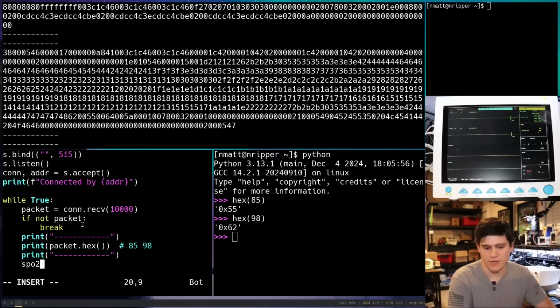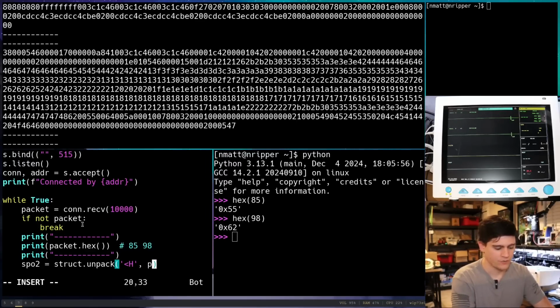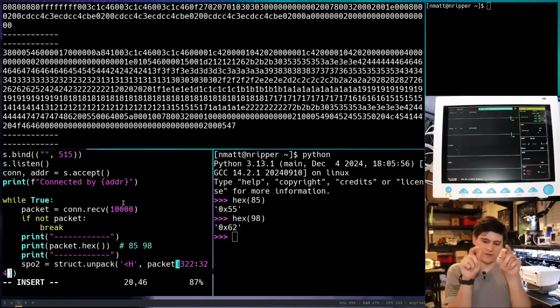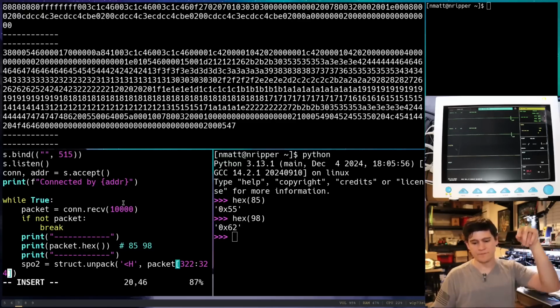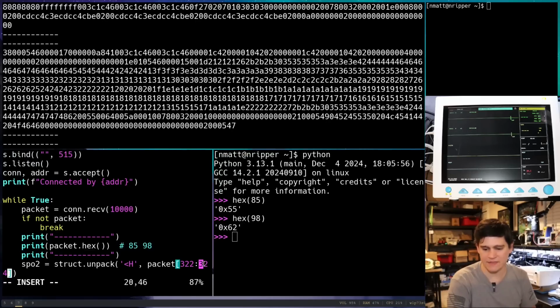Okay, so we're going to say pulse ox, which is called SPO2 here. We're going to set this equal to, and then we're going to use this cool struct thing, and we're going to say unpack. And then we are going to do this, which I'm going to explain in a minute what this means. But for now, I'm just going to write it. And then we're going to only take part of the packet. The part of the packet we're going to take is 322 colon 324, because we're slicing that packet data down to just those 2 bytes. When you do slices in Python, the first index is inclusive and the ending is exclusive. It doesn't include the byte at position 324. So it's actually just taking 2 bytes, the byte at 322 and the byte at 323. And so we're going to do that.